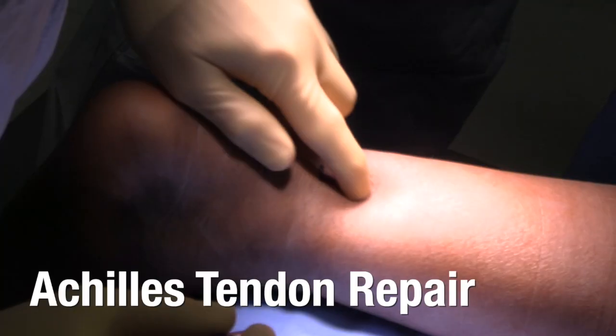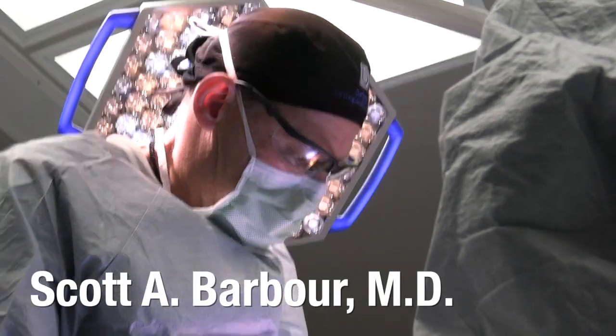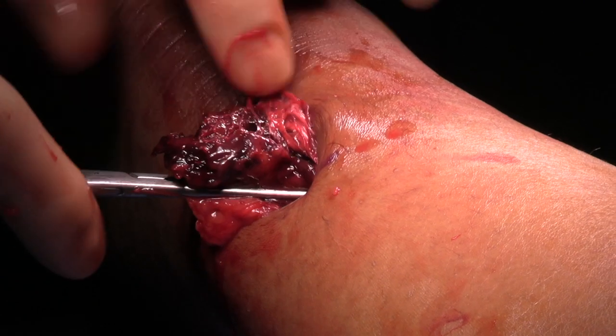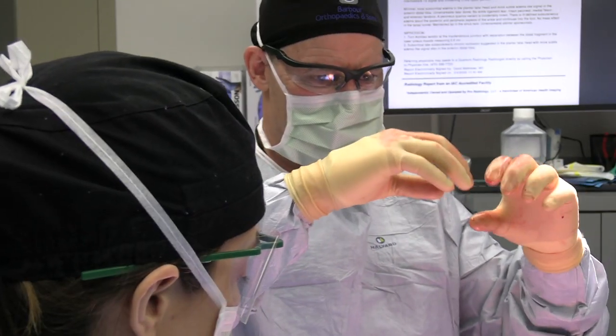Feel the tendon right there. It's kind of hard to feel the top so that we can grab it and pull it down. Usually mid-substance Achilles tendon tears are due to watershed areas. You have some of the blood coming down, blood supply coming down from the muscle, some coming up from the bone, and it kind of peters out in the middle — that's called the watershed area.